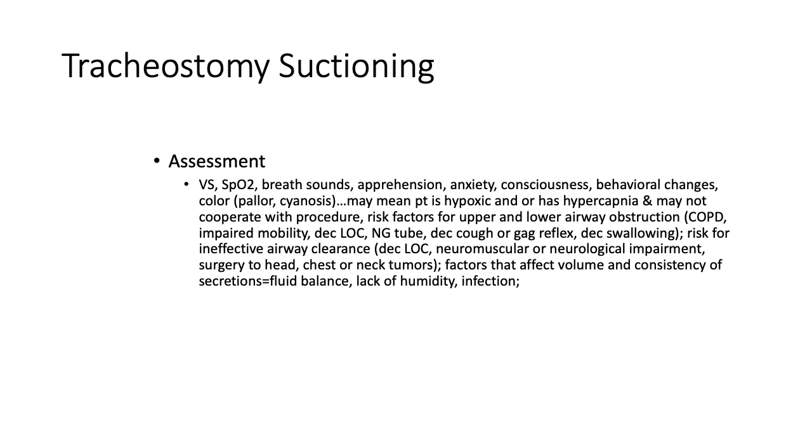Are they overhydrated, in fluid overload, where they're producing lots of mucus, or are they dehydrated, which would make the consistency thicker and harder to remove? Is there a lack of humidity? Decreased humidity means that secretions will be dry and thicker and harder to remove. Does a patient have pneumonia? Do they have any infection which might increase the amount of secretions and the thickness of them?